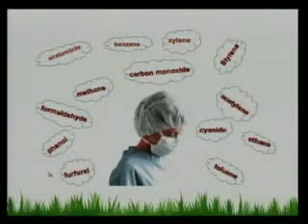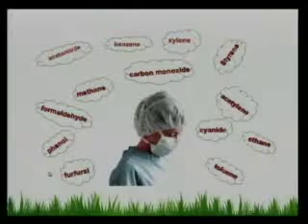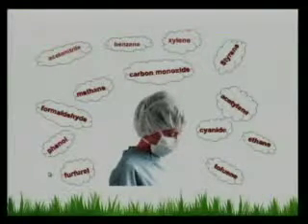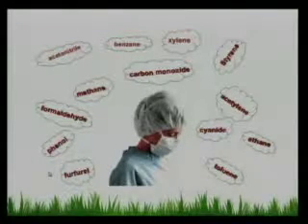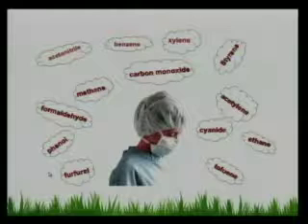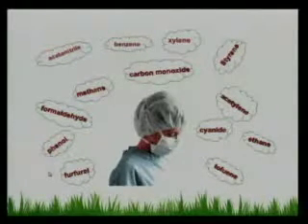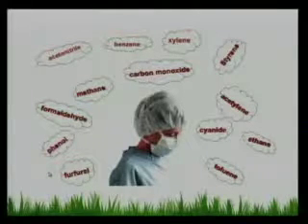The last safety thing I want to touch on is the smoke that's created when we do these procedures. I mean, you can walk by the labor unit and you know there's something going on. You know someone's using the Bovie. And research has really shown that the smoke that's created when we do electrosurgery is really similar to that created in laser, and that there's DNA viruses and bacteria, there's carcinogens, there's irritants in there. And really we're supposed to be using universal precautions when we operate.